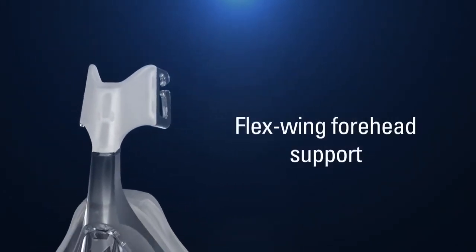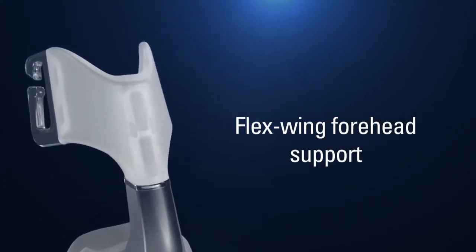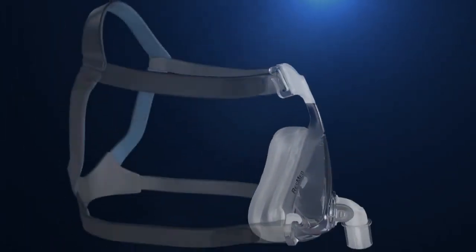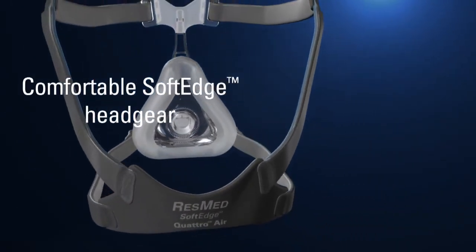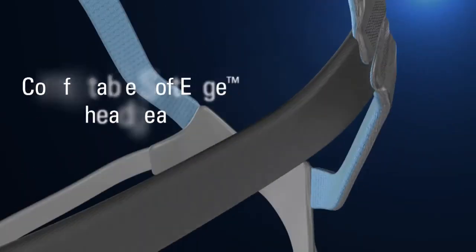Replacing the previous microfit dial is ResMed's flexible silicone flex-wing forehead support that allows minimal facial contact and alleviates a potential pressure point. Quattro Air's seamless soft edge headgear has a contoured crown strap that sits comfortably at the top of the head, limiting contact with sensitive areas around the back of the neck.